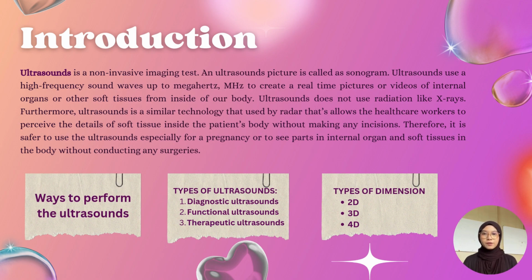Furthermore, ultrasound is a technology similar to that used by radar, which allows healthcare workers to perceive the details of soft tissues inside the patient's body without making any incision. Therefore, it is safer to use ultrasound, especially for a pregnancy checkup or to see parts of internal organs and soft tissues in the body without conducting any surgeries.